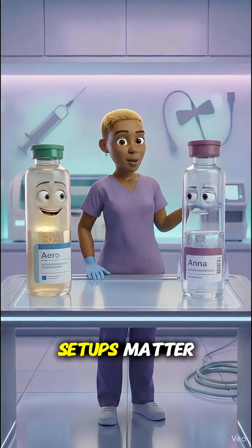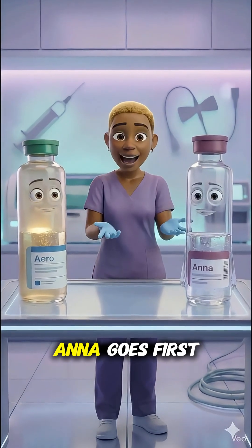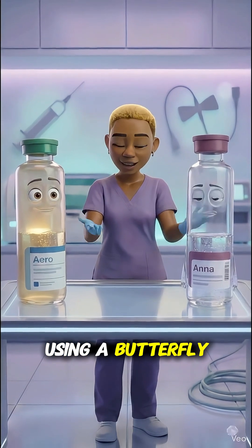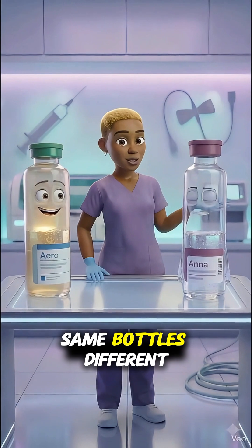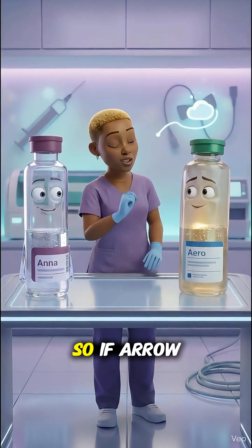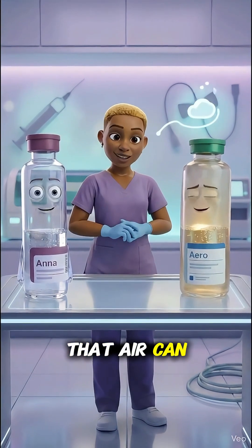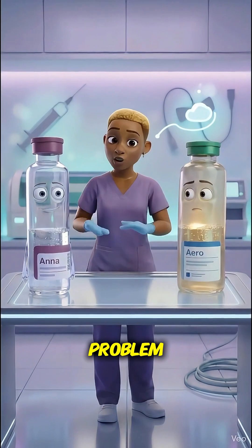Here's where setup matters. If you're using a syringe, Anna goes first. But if you're using a butterfly, Aero goes first. Same bottles, different setup. And here's why: a butterfly line has air in it, so if Aero doesn't go first, that air can get pushed into Anna — and that's a problem.